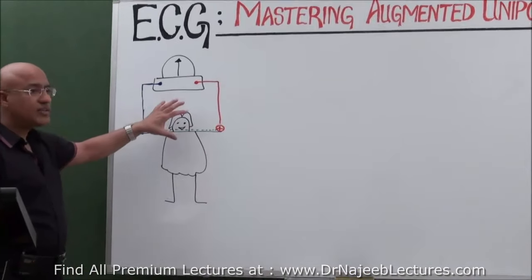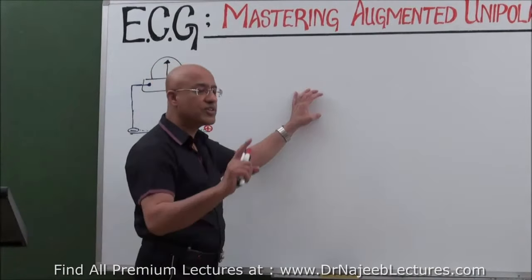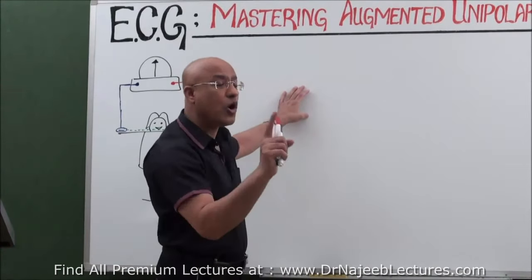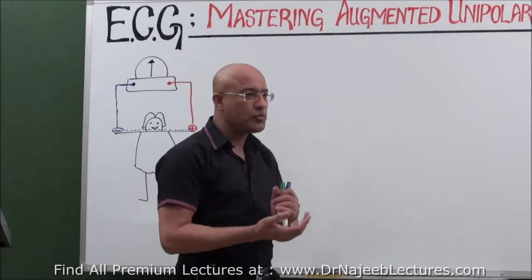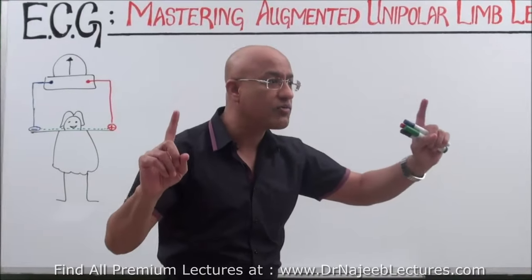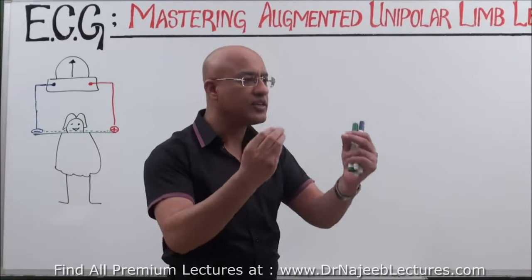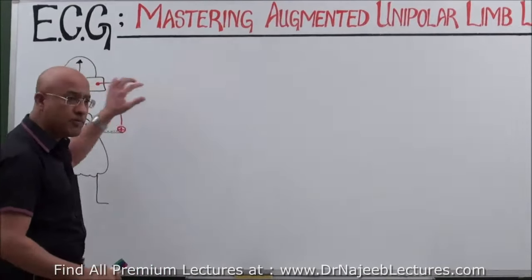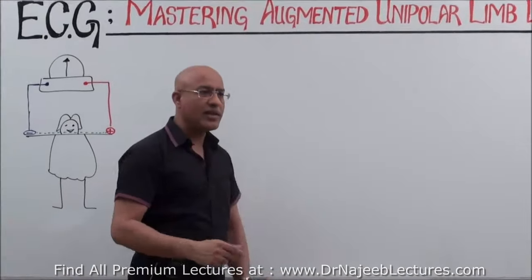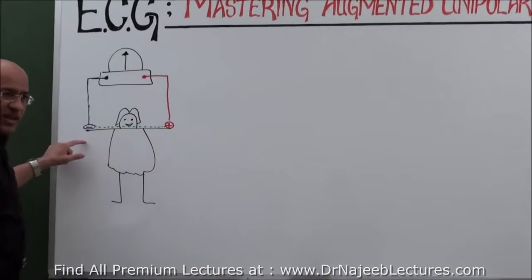Now, what is the real difference between bipolar leads and unipolar leads? First, I will talk about the unipolar ECG lead. Later, I will talk about the augmented unipolar lead. Remember, unipolar limb leads and augmented unipolar limb leads are somewhat different. First, let's talk about what a unipolar ECG lead is and how it is different from a bipolar lead. Now, in a unipolar lead, how many poles are there? In a bipolar lead, there are two poles, positive and negative.